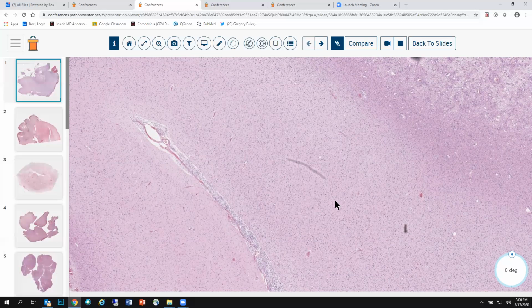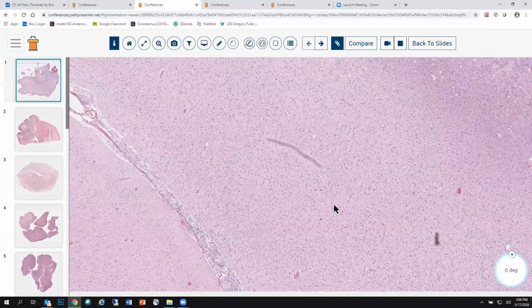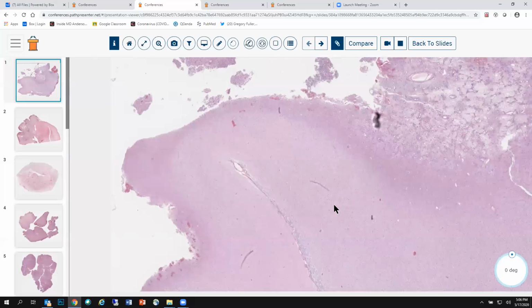And the first thing that we do is run immunohistochemistry for mutant IDH1 or R132H mutant protein. And if the tumor cells light up, the diagnosis is diffuse astrocytoma, IDH mutant, game over. If they don't, then we would have to pursue it with either PCR and probably other immunostains.